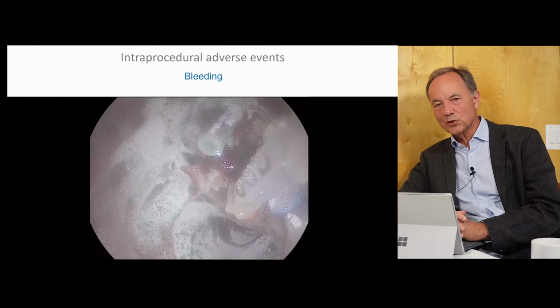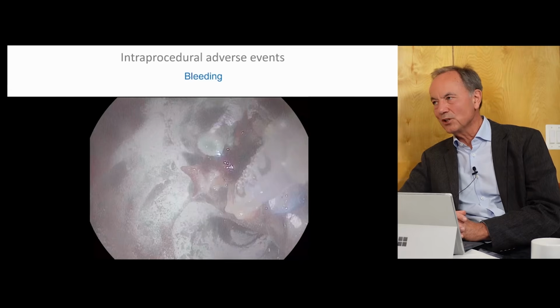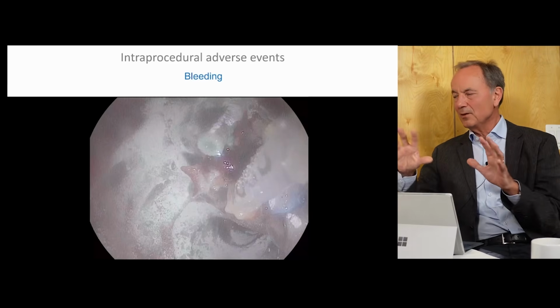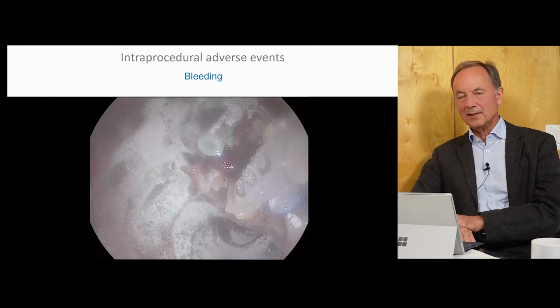Absolutely, and this is also a challenge sometimes for the fellow who sees the patient at night after papillectomy. So we shouldn't do these procedures on a Friday. Because this is really challenging. When you rescope the patient and there is a diffuse bleeding, it's very difficult to identify the bleeding site.